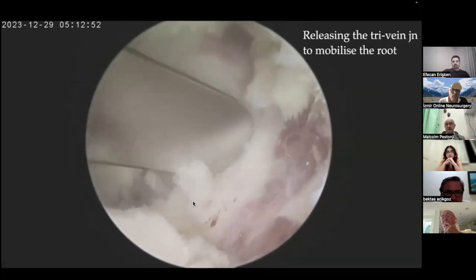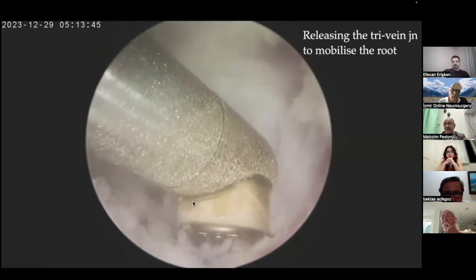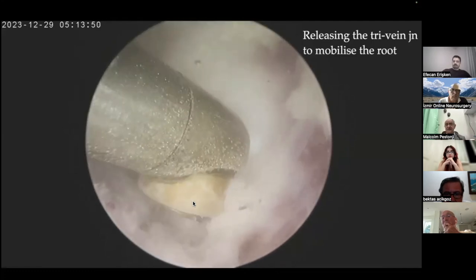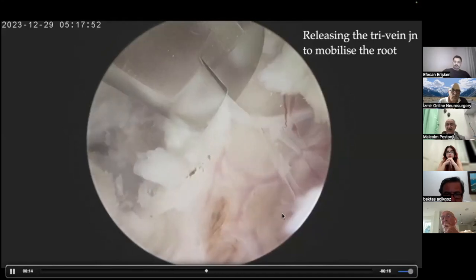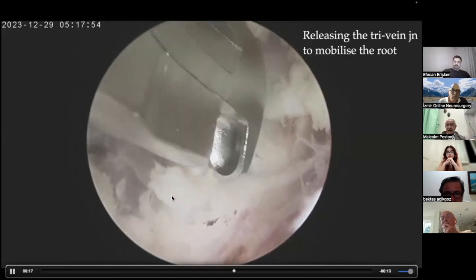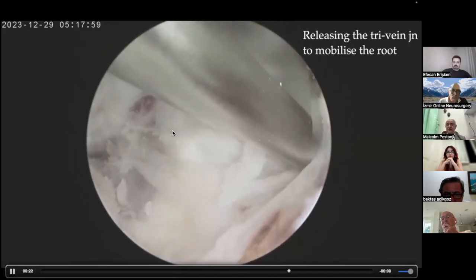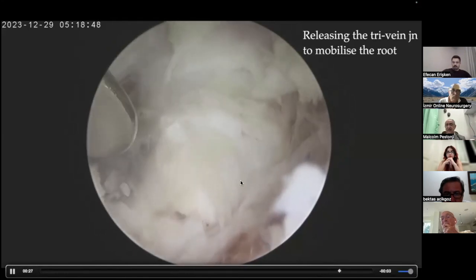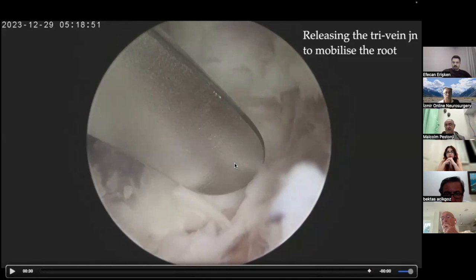See this video. When I push this vein away, you will be able to see this lateral disc bulge. See that. First, I'm using plasma, cauterizing the veins. There is a vein tethering the root over here because this vein and that vein are communicating. When I cut this vein cluster over here, below this Kerrison, you will see how the root falls off. Can you see this root falling off? And can you see this disc bulge? So the detethering effect is so important when you cut this venous plexus.